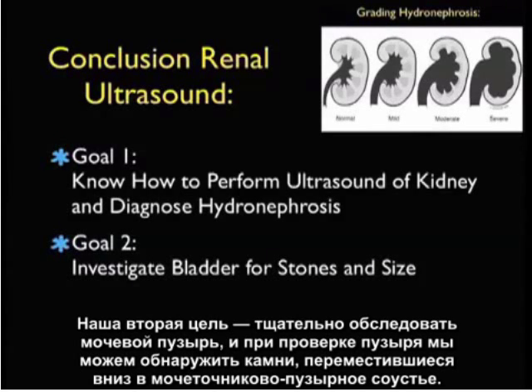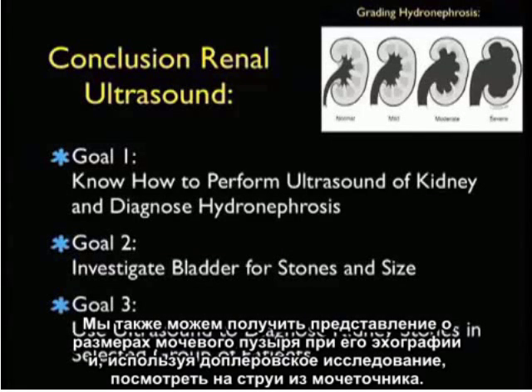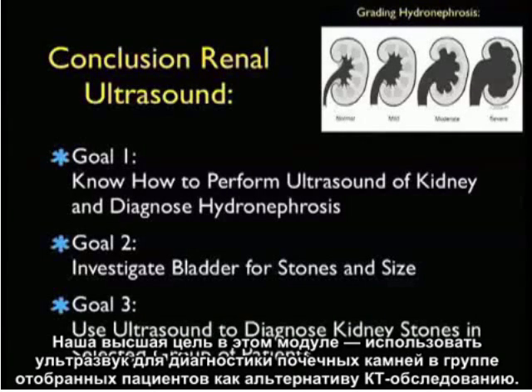Our second goal is to investigate the bladder closely, and we may be able to see stones that have migrated down to the UVJ on inspection of the bladder. We can also get a sense of bladder size on bladder sonography, and using Doppler we can look at the ureteral jets. Our overriding goal for this module is to use ultrasound to diagnose kidney stones in a selected group of patients as an alternative to CAT scanning.